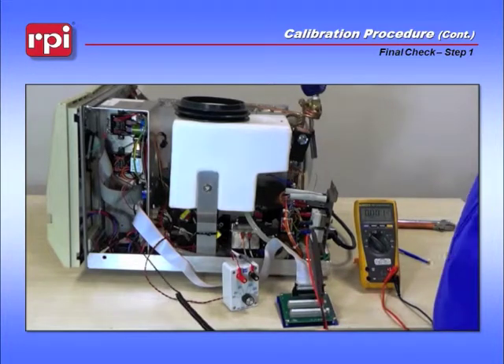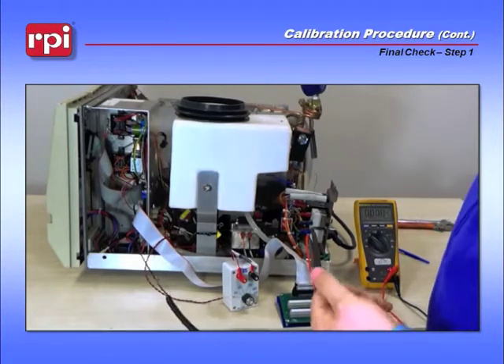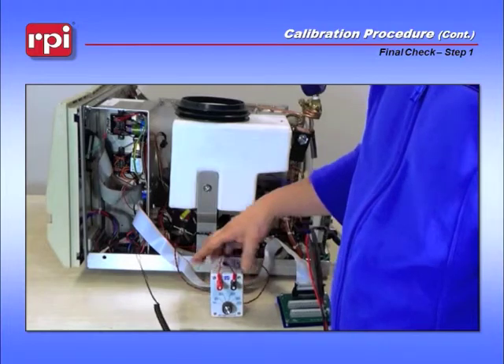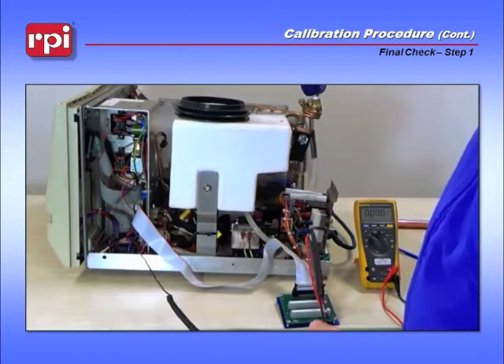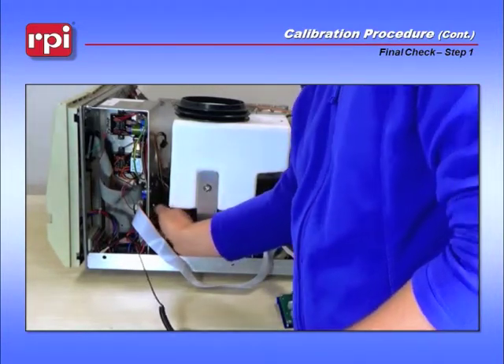Moving on, you need to make a final check to make sure that the unit is operating to its calibration. To do that, disconnect your TUT-114 from JP-11, set it to the side, and then reconnect your actual temp sensor for the machine.